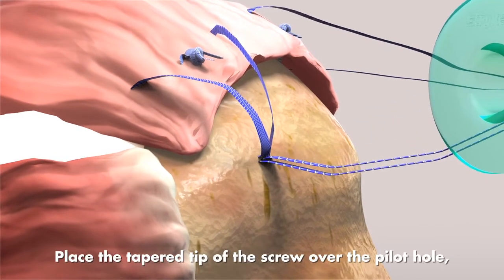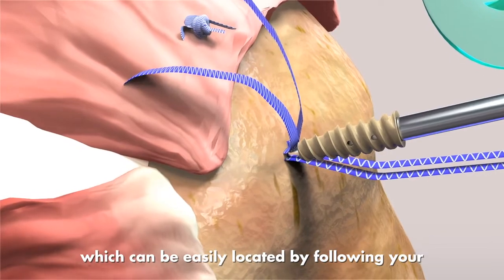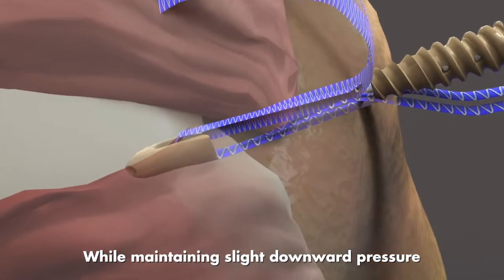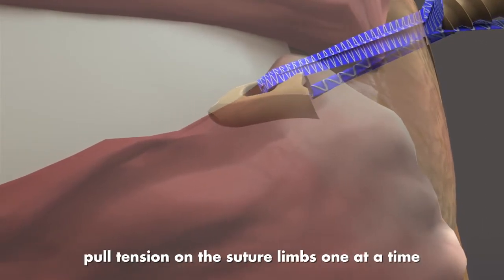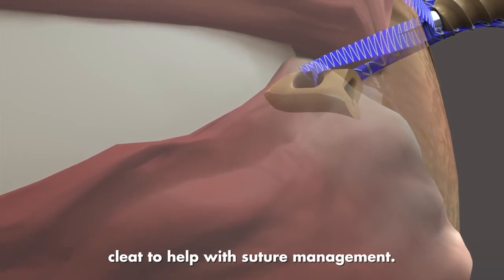Place the tapered tip of the screw over the pilot hole, which can be easily located by following your suture to the aperture of the hole. While maintaining slight downward pressure on the screwdriver handle, pull tension on the suture limbs one at a time and, if desired, place them into the cleat to help with suture management.